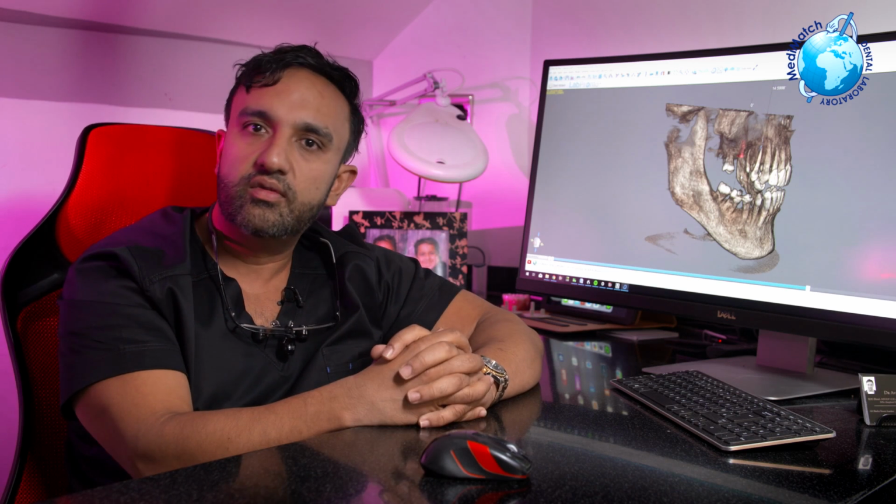And it was very exciting to show this particular case, and also some of the trickier bits of actually taking out a tooth, because dentists at the start of their career who've not done a lot of oral surgery will see that something that looks very simple, like an upper second premolar, which has got a root filling and needs to come out because there's not enough structure, and the actual difficulty of taking that tooth out, it's not as easy as it would sometimes seem, and the teeth may fracture and you may not get hold of it. And what I demonstrated today is, after many years of doing this sort of surgery, that even today it does take a little bit of time and patience and understanding on how to atraumatically extract the tooth in question, and especially on this particular case it was the upper right 5.